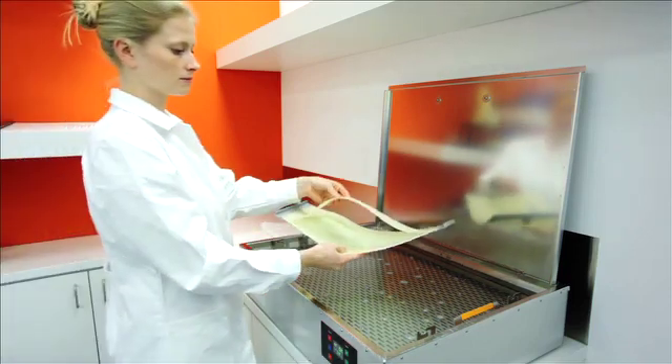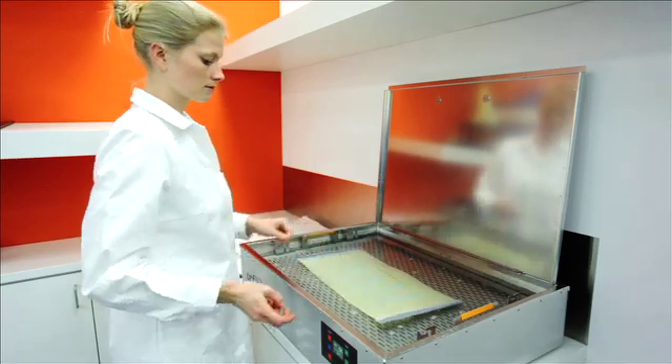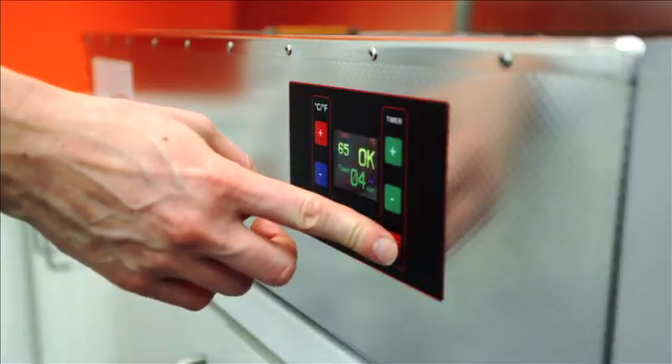Place the hybrid hip mask in the water bath at a minimum of 65 degrees Celsius. Make sure the nano reinforcement layer is facing upwards.